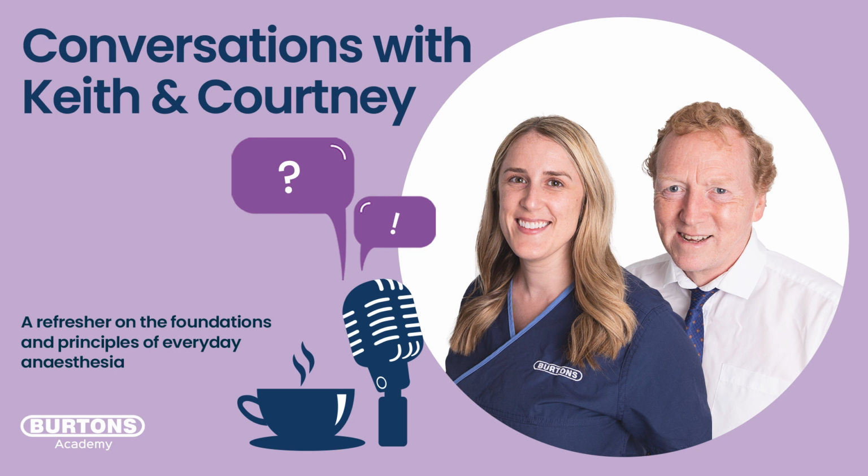So you give your patient its tidal volume and its pressure goes up to 12 centimeters of water pressure, and you think that's wonderful. Then the person doing the orthopedic repair puts the drill on the patient's chest, he or she has just drilled the hole. And then in order to gain access to the part of the ulna or whatever they're doing, they kind of put their elbow and just push down a little bit as they try and reorientate that radial fracture. And the next breath goes up to 20 centimeters because we've squished the chest. In other words, we've limited its expansion. So we've changed its compliance.